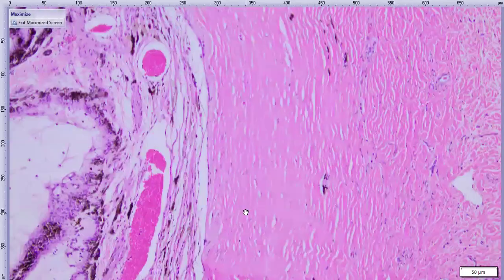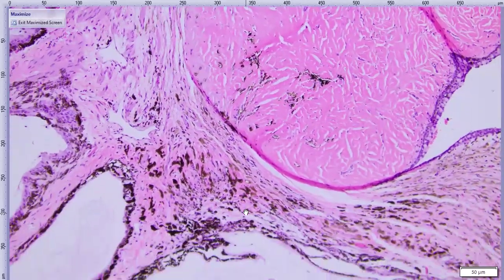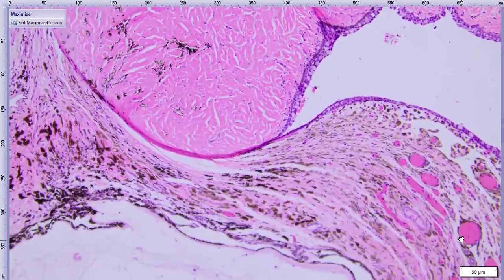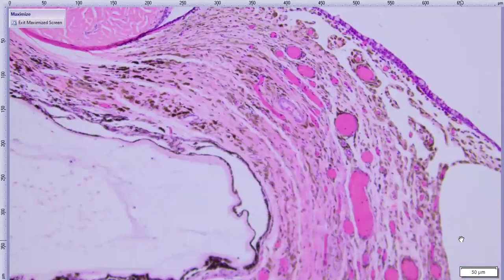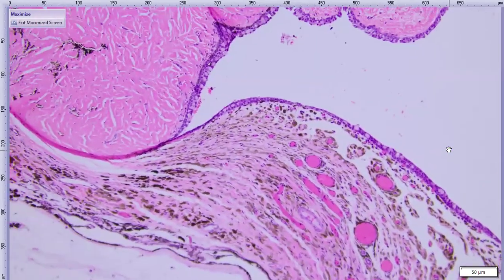Collagen fibers are looking a little bit thick and disorganized, and then basically there's no cornea. And indeed, we do have this prolapsed iris. So this tissue that's coming through the defect here, it's all iris. Edematous, congested, you've got these big dilated vessels, you've got these big clear spaces in the tissue. It's become our new ocular surface.